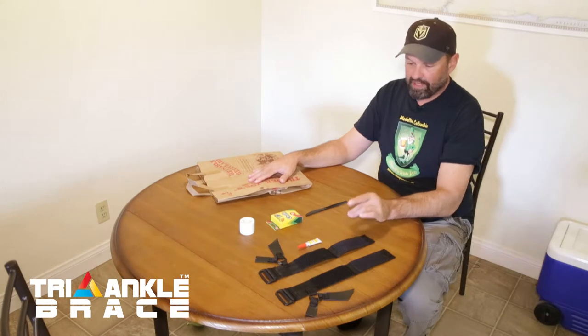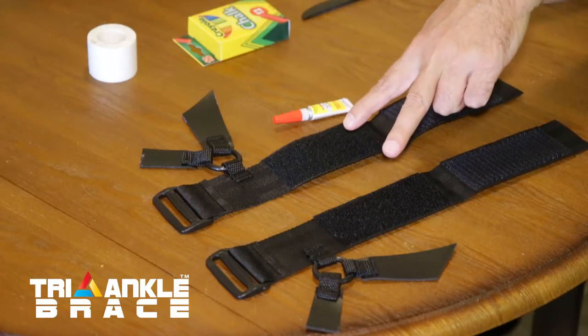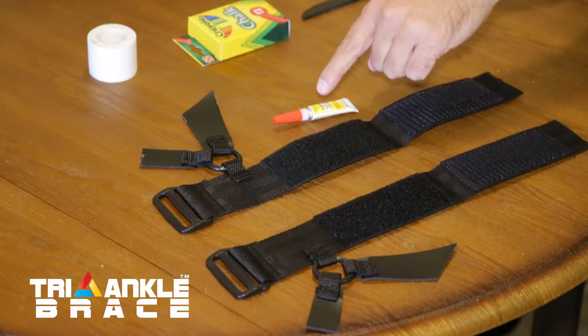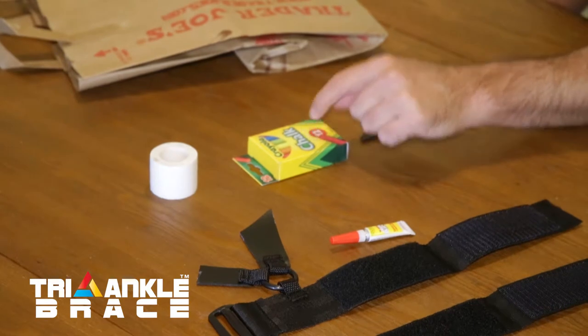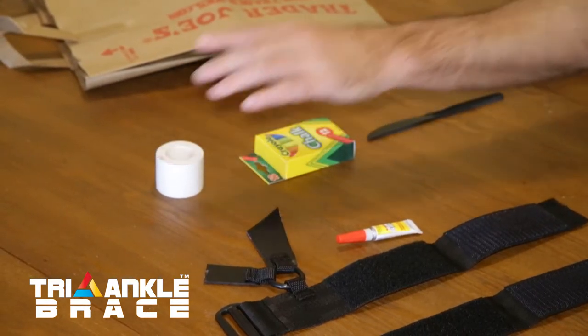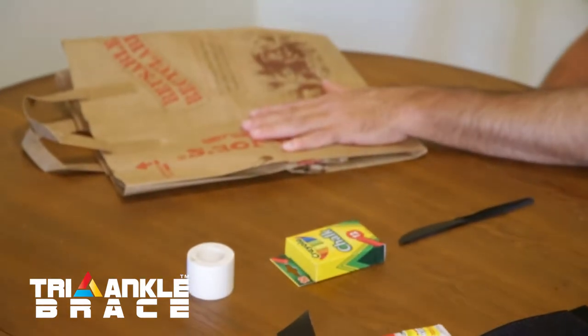You've got your triangle braces in the mail and you unpacked them. Here's everything you're going to need: your two braces, the left and the right, and the glue that came in the packet. You're going to need something to mark your shoes, something to hold the braces on while they dry, maybe something to spread glue, and something to protect your workstation.